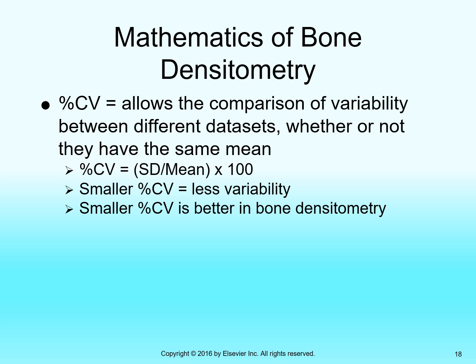Okay, with a smaller CV ratio percentage, there's less variability, and therefore a smaller percent CV means that the measurement you've taken is more believable. Okay? Because you're not getting a lot of variance in your measurement.